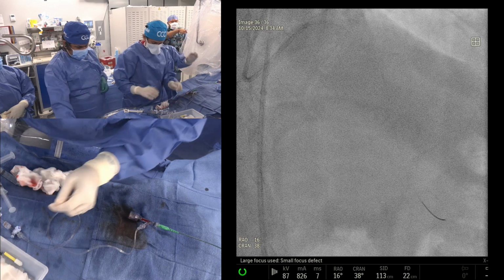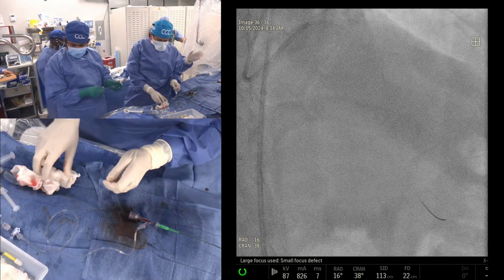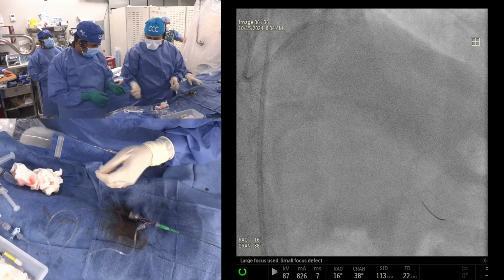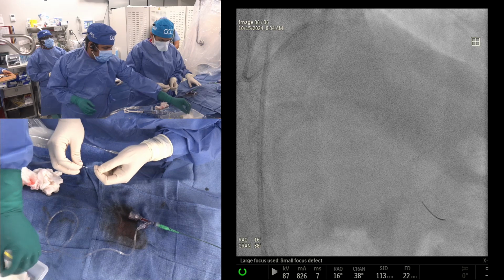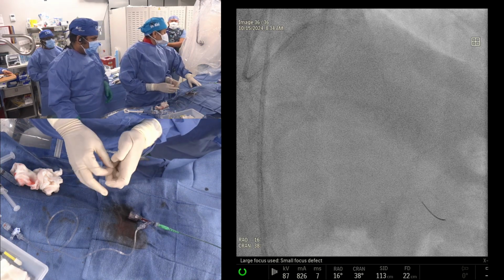And you saw that once it's not needed, take the contralateral catheter out. Why leave it? If you start having some trouble, a dissection or more so clot, just take it out. So we did it already. We have taken the right catheter out now, the contralateral.